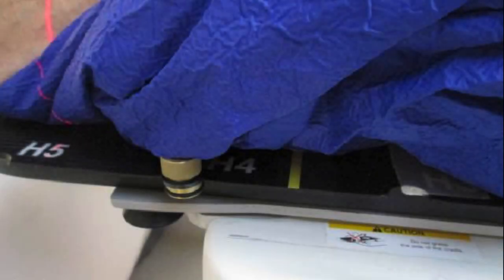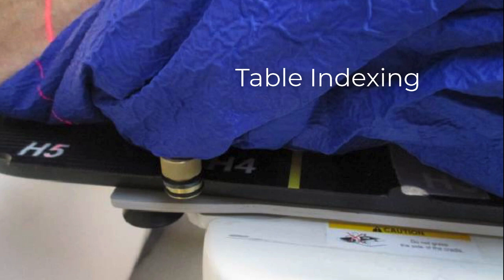Another simple technology worth mentioning is table indexing. You can see in this image that there's a marker on the table, and the device plugs into that marker. And so if the device is in the same position on the table every day, meaning the patient is in the same position, then that table should also be at a position. And then there can be an electronic interlock on that, so you know that if you're outside that position by some tolerance window, then an interlock can be thrown. That's called table indexing. It's an important safety feature and a way to reduce interfraction variability.